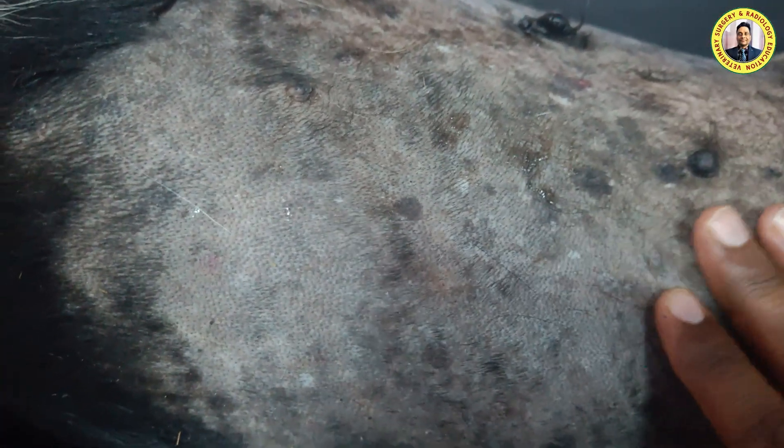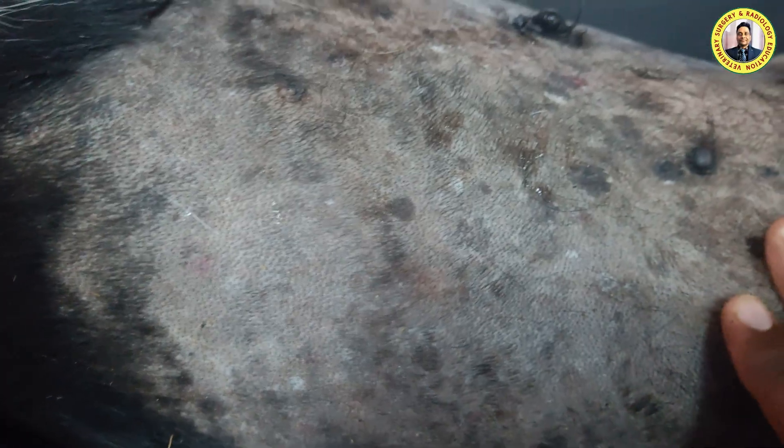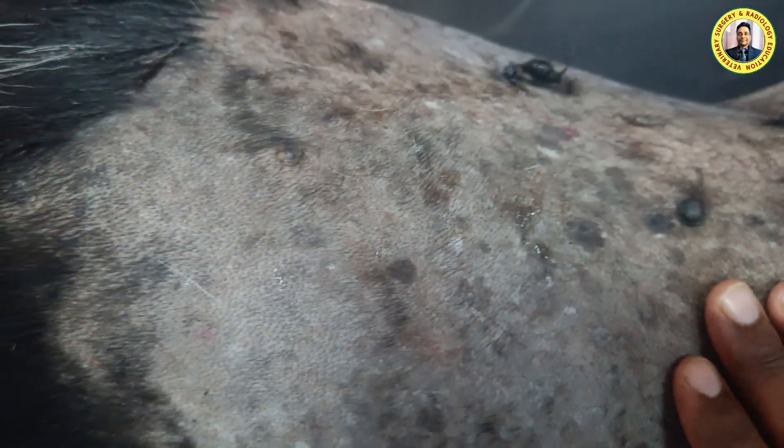Today we have a case which is referred from medicine for ultrasonography. The history of this case is that the animal is not eating for the last three days, not passing proper feces for the last two days, and also has a history of fever.